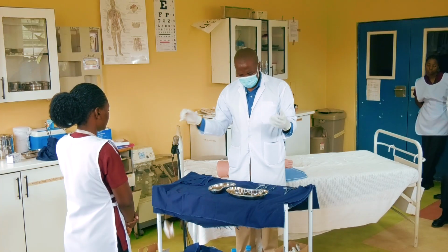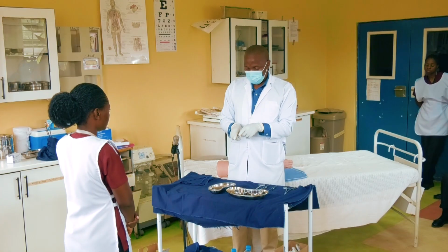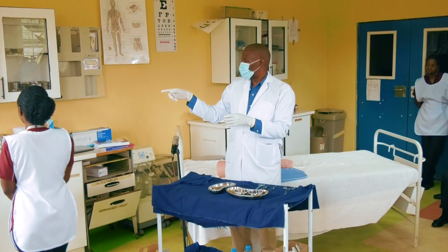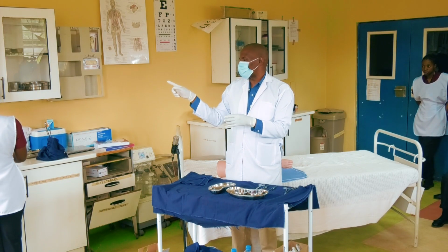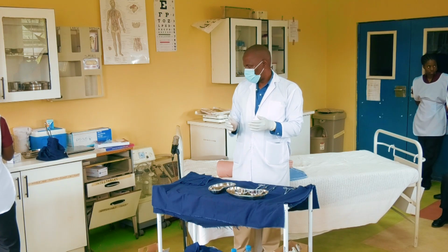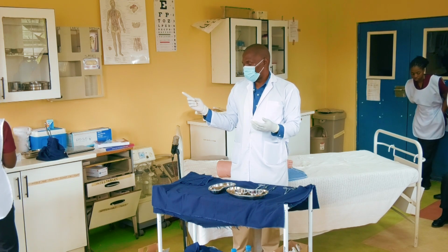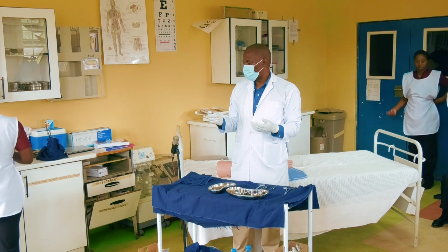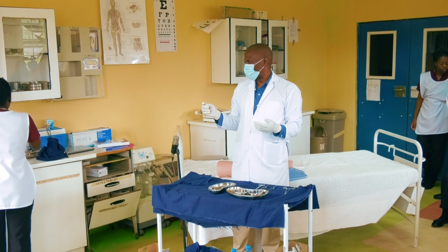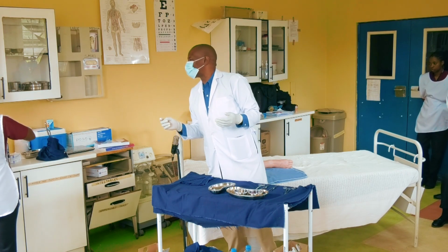Okay. Drop that one. What else do I need here? I left this other part. I think cotton was supposed to come here. Check the drums first. Since he has gloved in, he's not supposed to touch there, so just check for it. Check for cotton. There's another drum, the small drum. I'll need it. Cotton swabs, that's what I want.